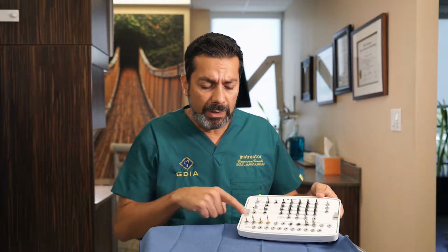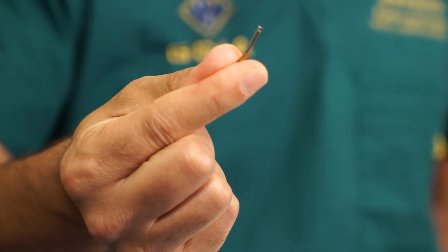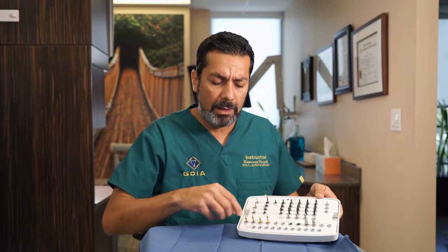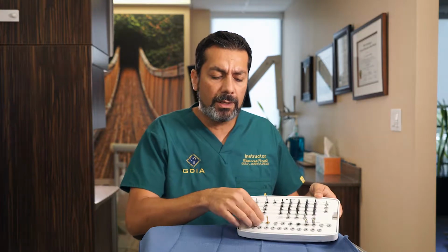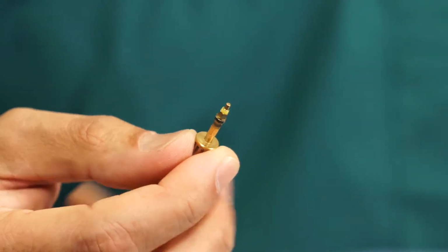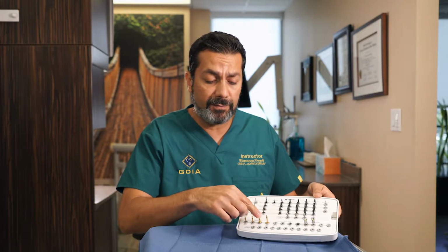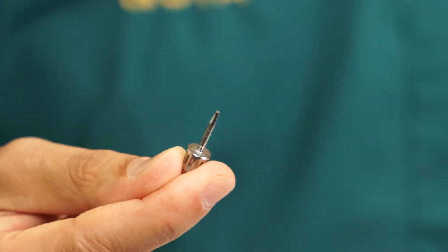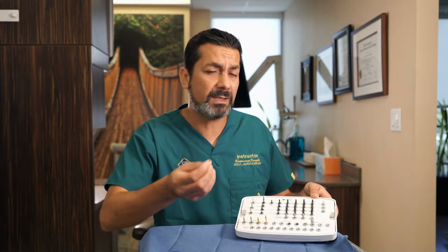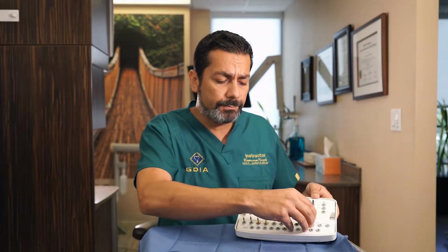That's why I've taken all my I-Clean drivers, which are the green ones, out of the kit. So when it comes to your implant drivers, you have 2 that are latch type that go on your contra-angle. One is short, one is long. And then you also have 2 that are manual drivers that go on your torque wrench, also a short and a long. So these are your implant drivers, and these 2 are your abutment drivers. These are used to put on cover screws, healing abutments, final abutments, any kind of abutment. They also come in a short and a long.